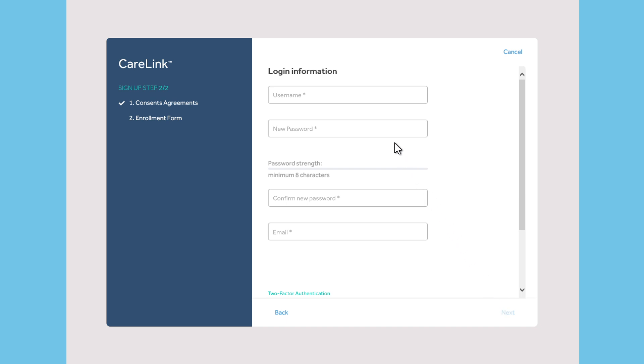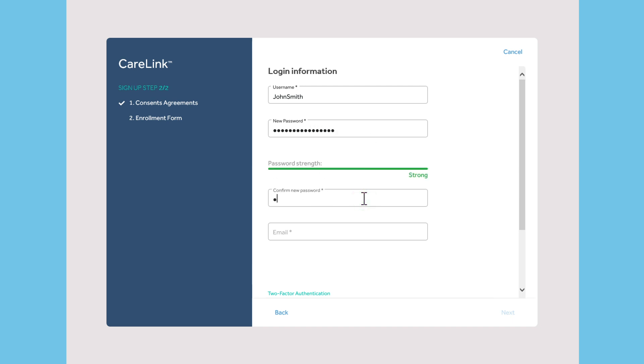Now, fill out the enrollment form and create your personal profile, which includes a username and password. Please save this information in a secure place for future reference. You will need this information to log in to CareLink software from a personal computer, and when you use applications that link to your CareLink account.